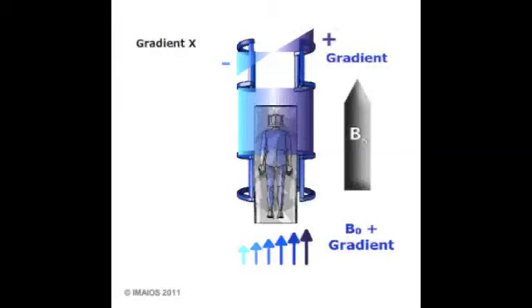Let's look at the image that you saw on the website, IMAIOS. Look at the picture of the patient lying in the bore of the magnet. He is face up, his head went in first. So right now in your chair, looking at the TV screen or the computer monitor, I want you to spread your left and right arms out. Spread them all the way out like you're going to come up to your best friend and give them a hug.